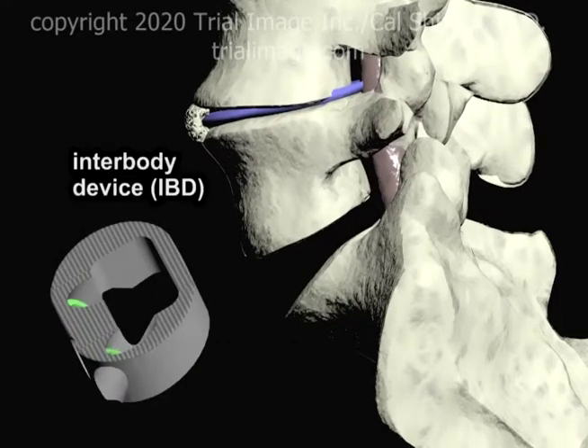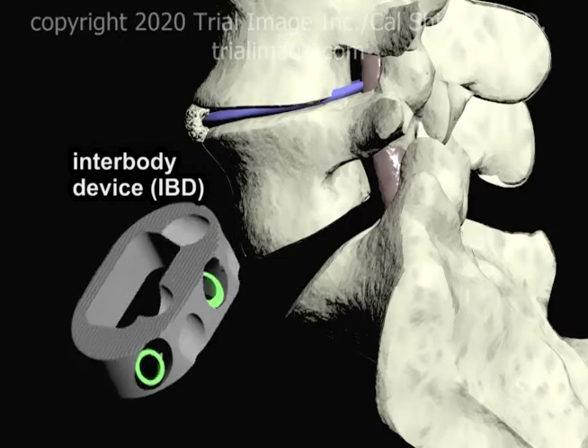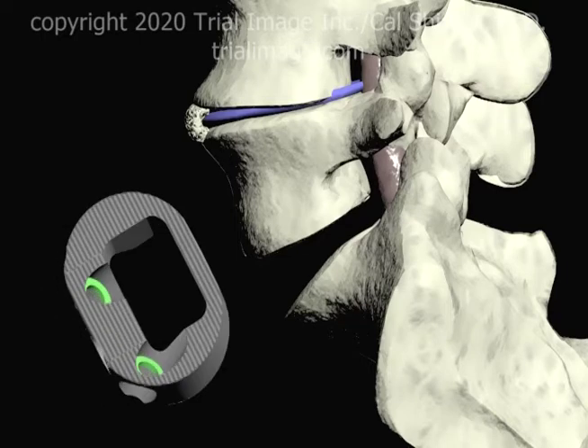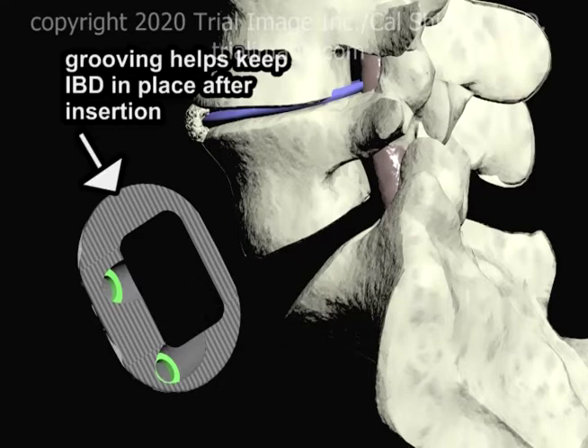The interbody device, also known as a fusion cage, is typically made of carbon fiber or titanium, and has an open center to allow for the placement of graft material. Grooving helps to keep the device in place after insertion.